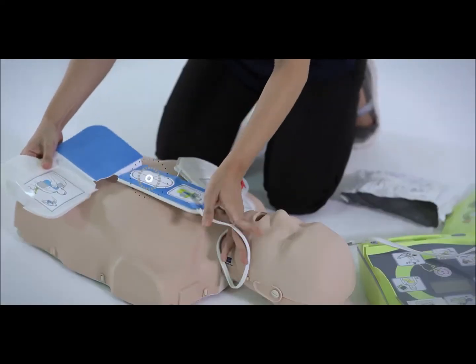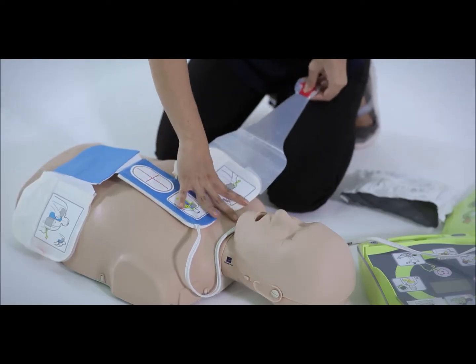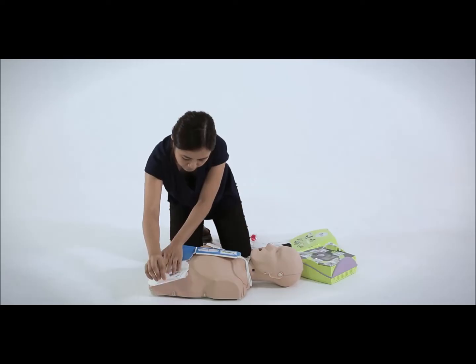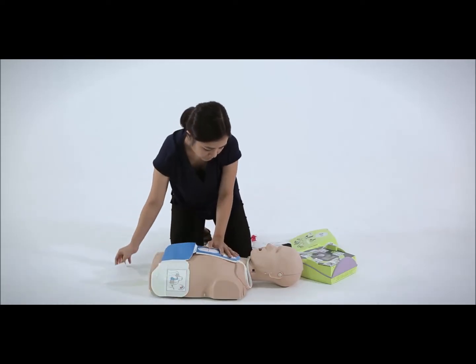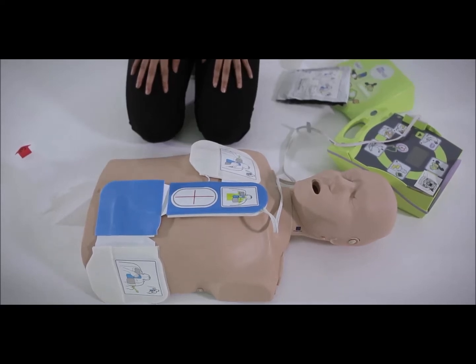Press the CPR sensor with your right hand and peel away the protective backing that is attached to the electrode pads. Press the electrode from the center out to make sure that it adheres properly to the victim's skin. Once the pads are applied, the AED will automatically analyze the victim's heart rhythm.